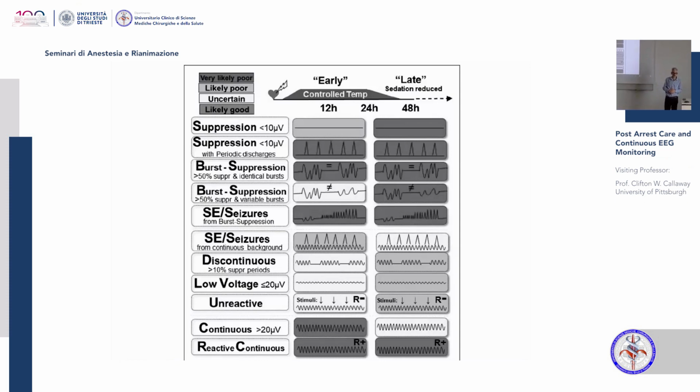So his recommendation was, get the EEG initially, then get it again sometime later, 48 hours, somewhere in there. And those two pieces of information will tell you something about the trajectory of that patient. So just like the data I showed you, if you don't have continuous EEG, getting two snapshots will tell you something about how the movie is unfolding. And 48 hours is a reasonable time frame to be looking at those snapshots. A lot of combinations there.